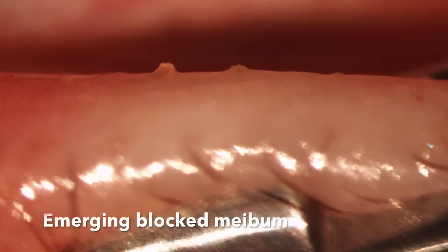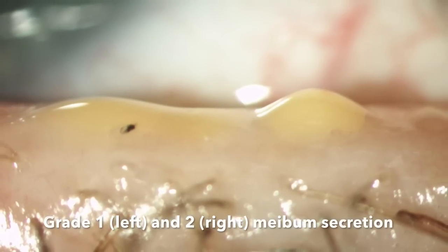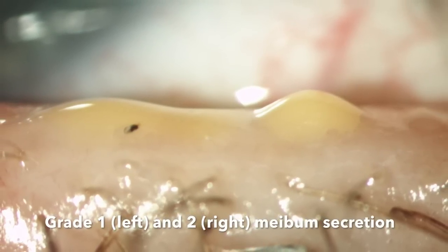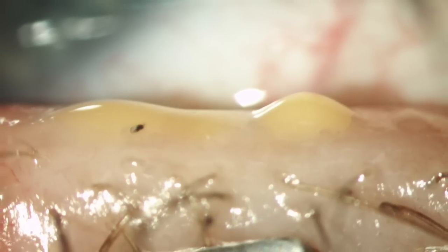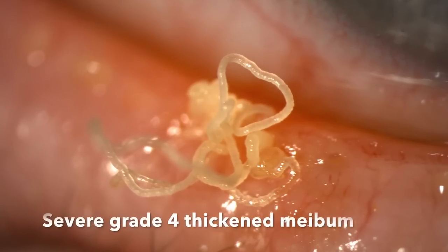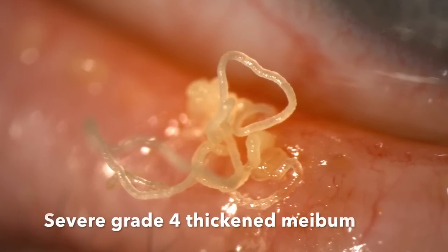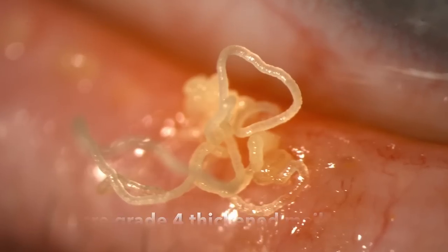Here we can see the meibum as it's emerging from the blocked glands with pressure. This image shows on the left a grade 1 blockage and on the right more like a grade 2 blockage — often adjacent glands are not the same grade or level. This image shows an obvious severe grade 4 thickened meibum, very blocked with quite a lot coming out with expression.